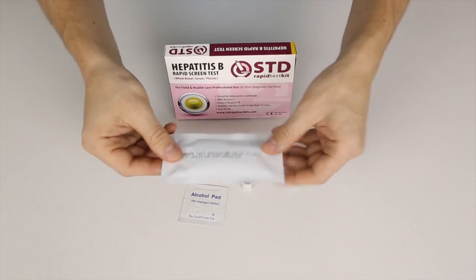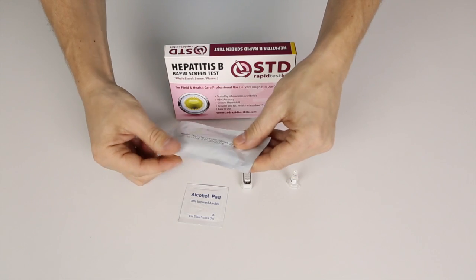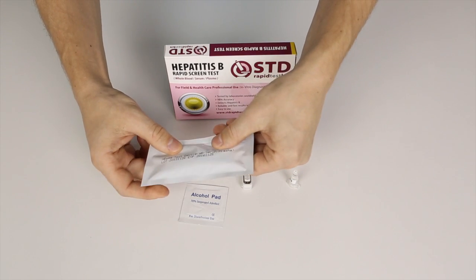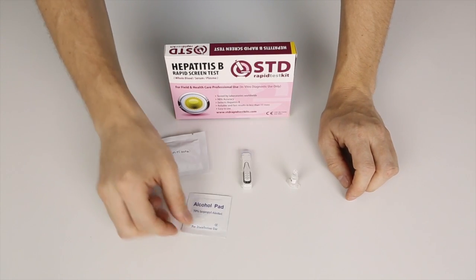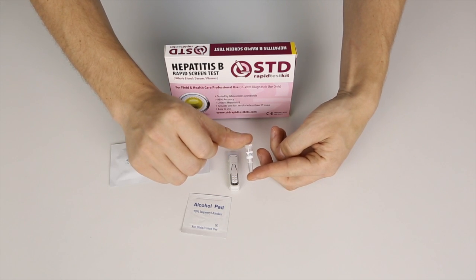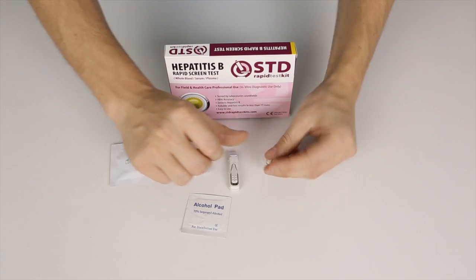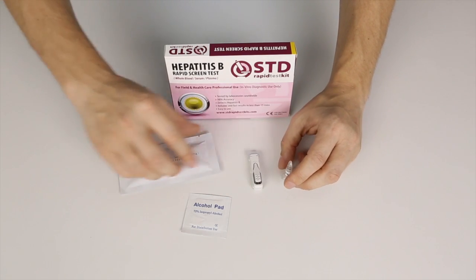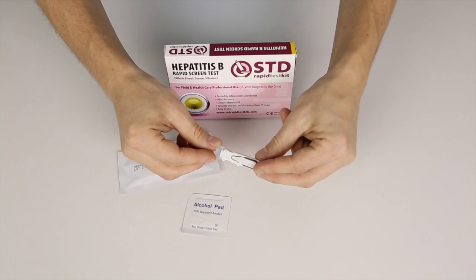This is the pouch containing the test cassette itself — the one showing you the result. It also has a micro pipette inside of it. This is an alcohol prep pad, which is used to sterilise your finger before you carry out the test. This is the dilution liquid — it's the chemical that reacts with your blood and then provides you with the final result. And that's just the lancet. The lancet is the one you use to prick your finger.